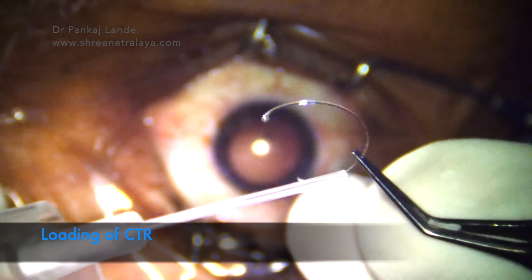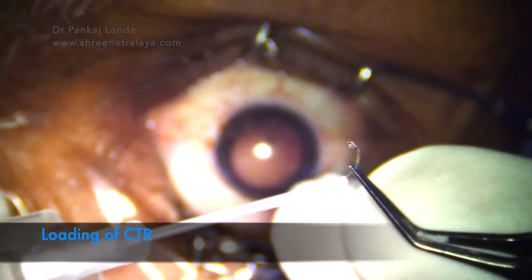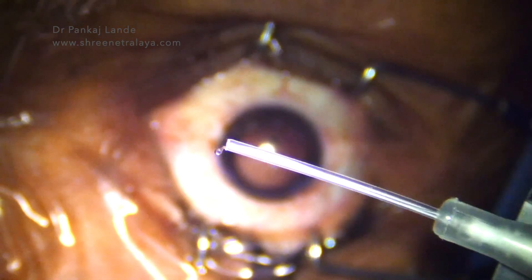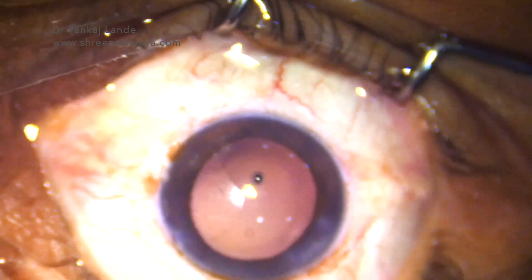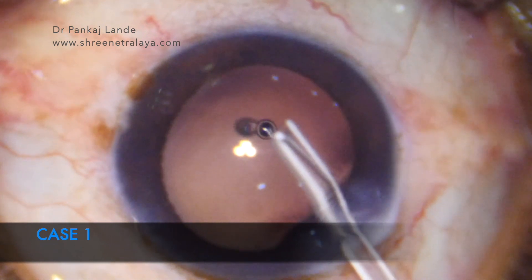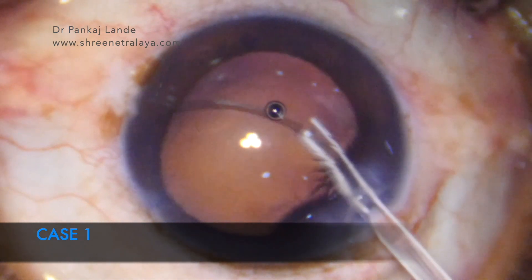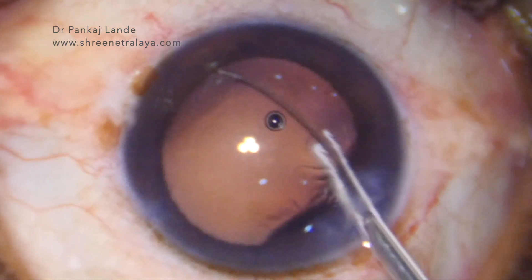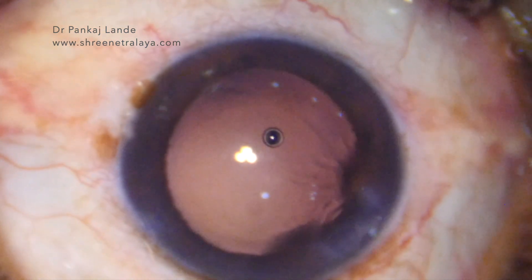Now we will load our CTR. Loading of CTR into the IV cannula is not a difficult task — it can be done with the help of forceps. The eyelet is seen protruding out of the IV cannula. Now insert the CTR into the capsular bag through the main port incision. Go close to the rhexis and start pushing, guiding CTR insertion into the bag. Once the distal eyelet is about to come out, go below the rhexis and insert it directly into the bag so that you don't need a second hand.